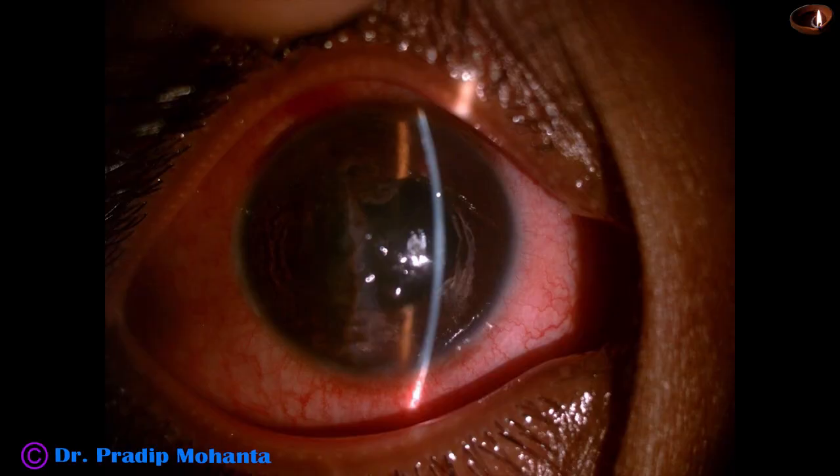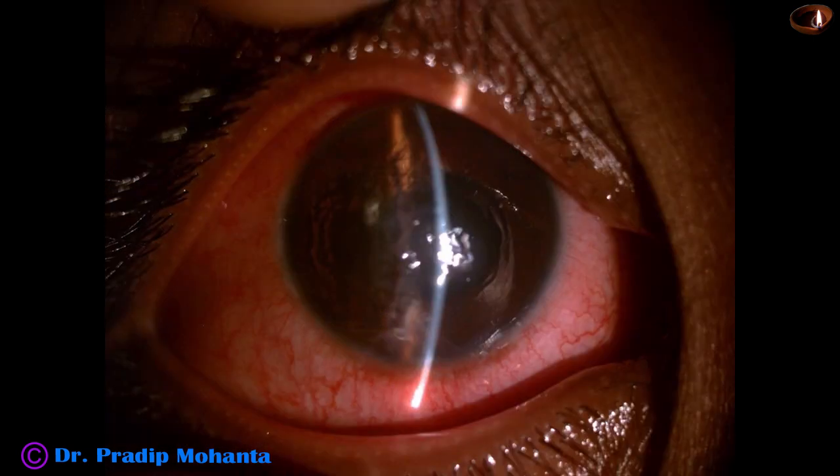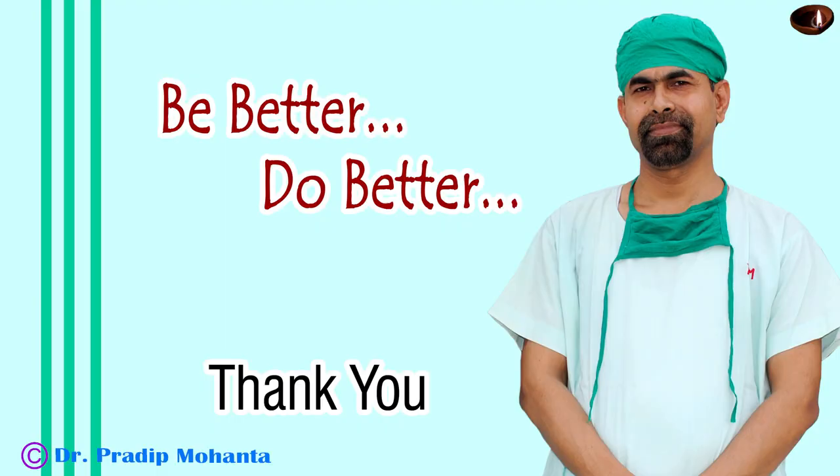These are some post-op pictures taken after 24 hours. The cornea is clear, the anterior chamber is nicely formed, with very minimal reaction — the anterior chamber is almost quiet, probably because of the subconjunctival dexamethasone. Thank you very much for your attention. Hope this video will help you in managing your traumatic cataract cases.